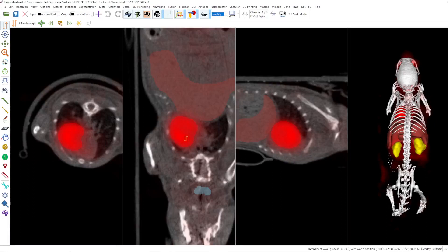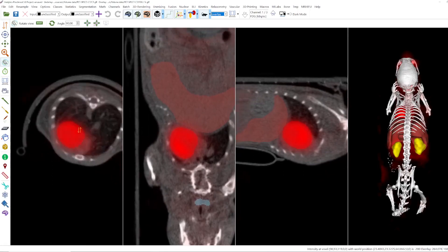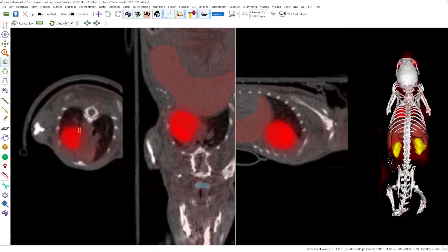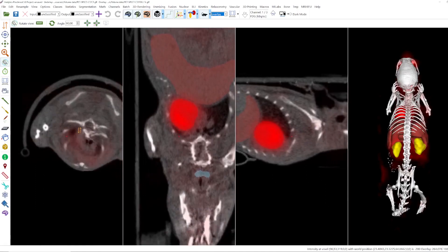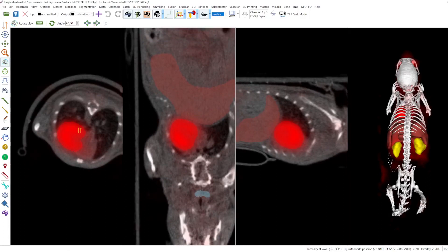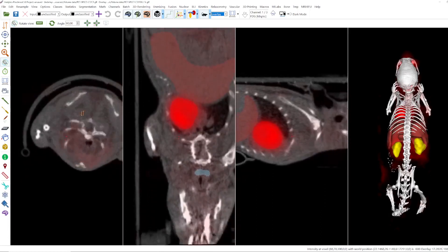You can also use the mouse to slice through even when you have another mouse action activated. For example here I have rotate activated. However, when I use ALT and the mouse wheel you can see that the mouse cursor changes to these two orange arrows and I scroll through the sample. With ALT and the mouse wheel I can slowly slice through, and when I use only the mouse wheel it's faster.